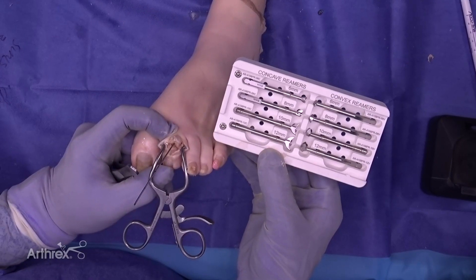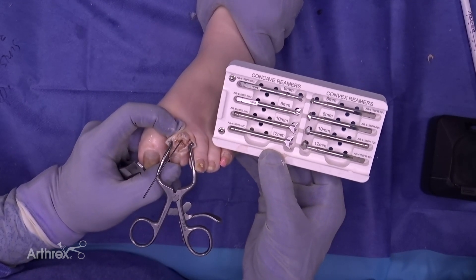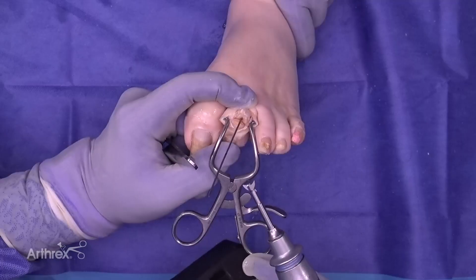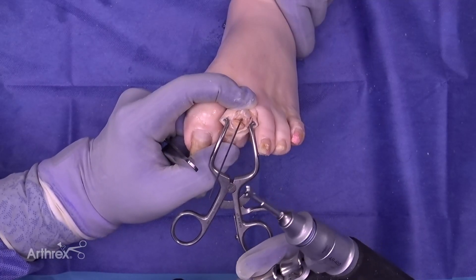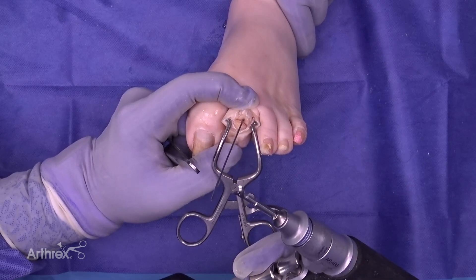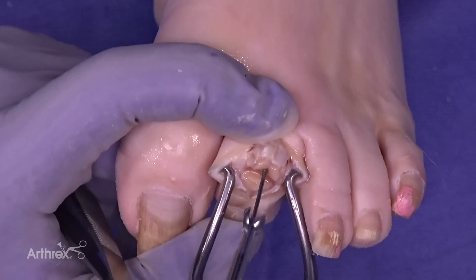We're able to utilize the concave and convex reamers, similar to the first metatarsal phalangeal joint, to prepare the fusion site in the second digit. Another unique feature is the end, which is a three-prong design, making it a bit easier to introduce down to the articular surface on the head of the proximal phalanx.